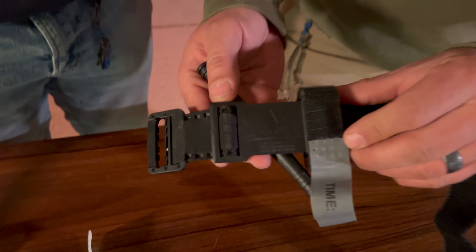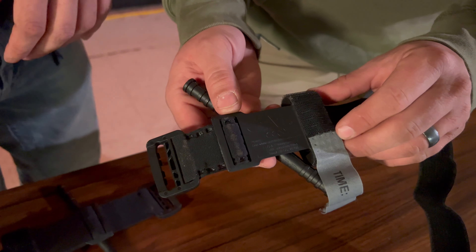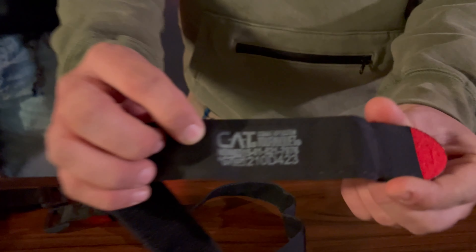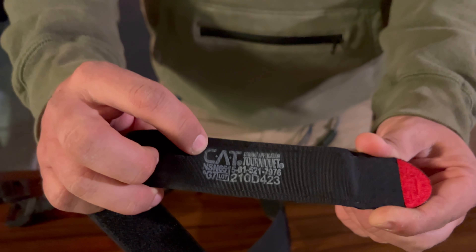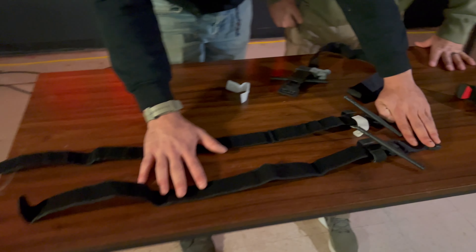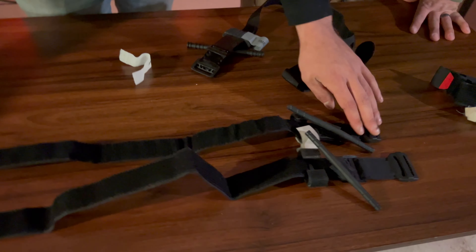You'll notice on the back plate of the fake that it's blank. If China doesn't write their name on it, they're probably not proud of it — they'll put their name on anything, so if they're not, beware. This is a genuine Gen 7 CAT tourniquet — you can see it says 'CAT,' it has its NSN number, proper documentation, and serial number. On the band next to the end tab you also have the NSN number, expiration date, and 'Genuine CAT Tourniquet' printed on it.